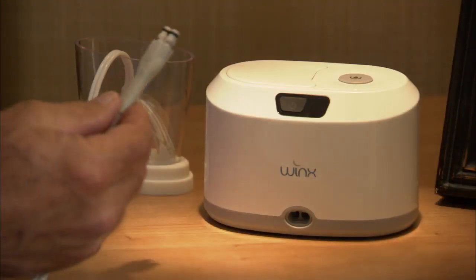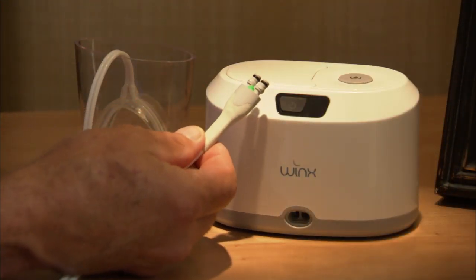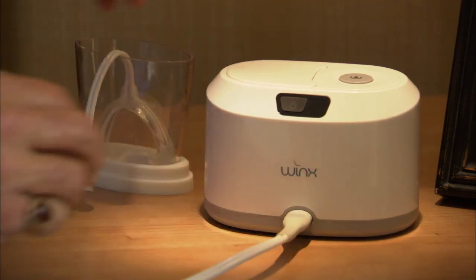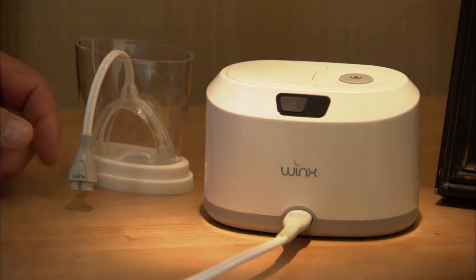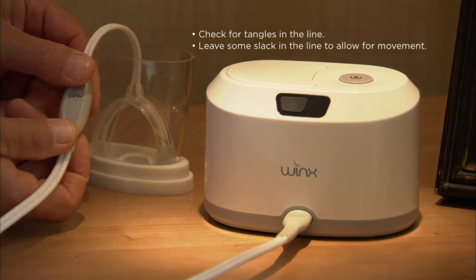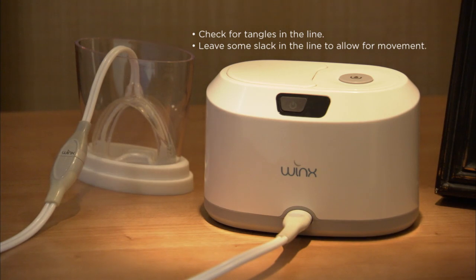Insert the tubing connector into the front of the console, triangle side up, until it clicks into place. Insert the other end of the tubing into the mouthpiece connector. Make sure the tubing will not tangle or kink while you sleep. Be sure to leave some slack in the tubing to allow for turning over or moving while sleeping.